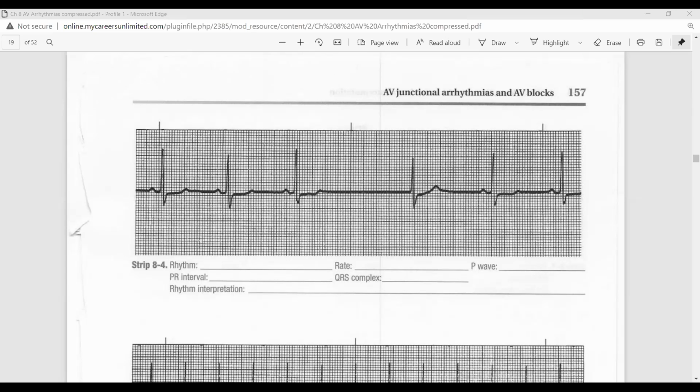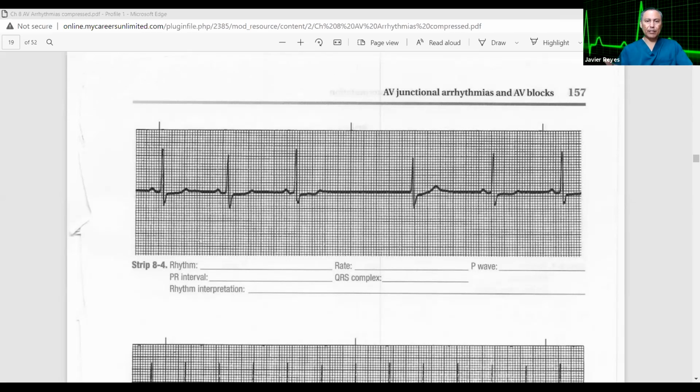Look at you getting the rhythm of this. I'm telling you, if you know this, Cynthia, you can understand more things than most nurses won't understand. Because in evaluating rhythms, not everybody can do it. Not even RNs, not even LVNs, and sometimes not even some doctors. They forget about it. They can tell basic rhythms, but evaluating a complete 6 second strip is a little bit more challenging. So it says a sinus Brady with a junctional escape beat after a pause in a basic rhythm. So you have that sinus arrest pause.